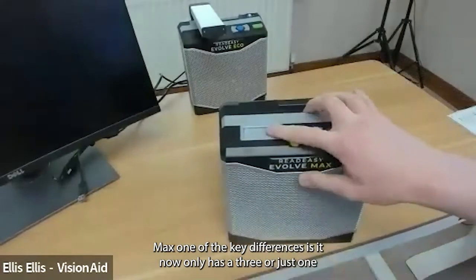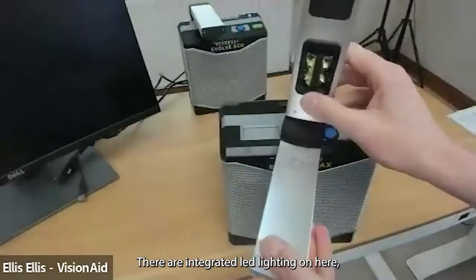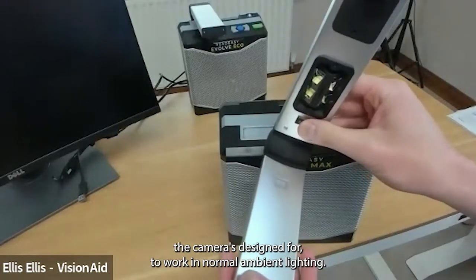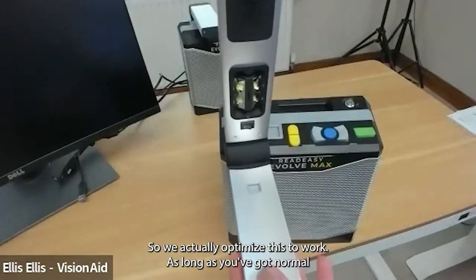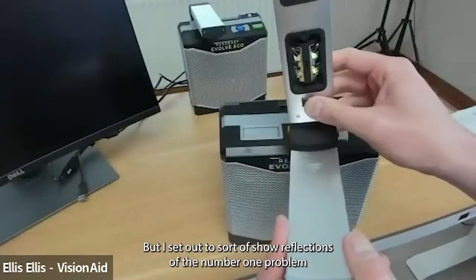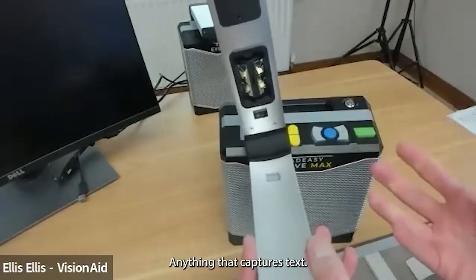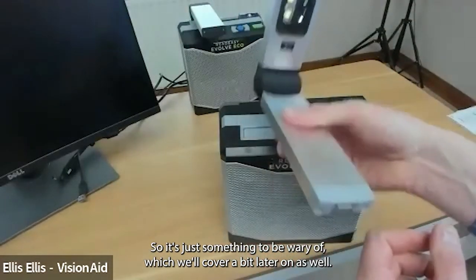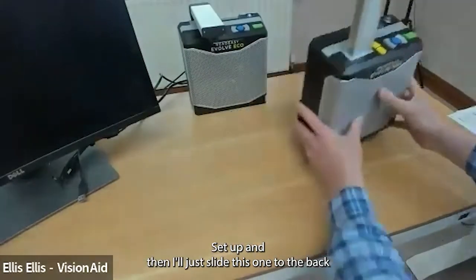On top of the Evolve Max, one key difference is it now has only one camera port — an A3 camera port. The camera unfolds easily and there are integrated LED lights, but the device is designed to work in normal ambient lighting. Lights on cameras like this can cause reflections because you haven't got a wide field of view from the lights, so we optimized it to work without the lights on. Reflections are the number one problem for text-to-speech devices. The camera slots in nicely and that's it set up.